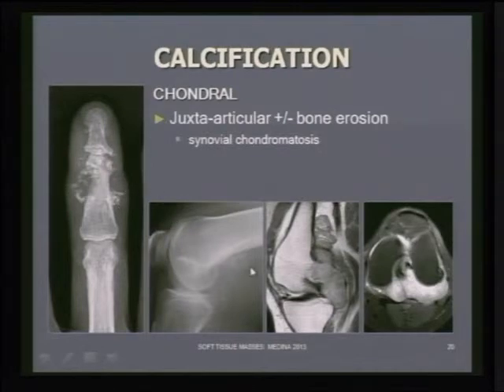And another slightly more subtle example here in the popliteal fossa, in this lateral radiograph of the knee, indicative of a very extensive area of synovial chondromatosis when we look at the MR study, invading the posterior recess of the knee joint and extending onto the medial side here. So again, a pointer then: calcification adjacent to joints, then think about synovial chondromatosis.